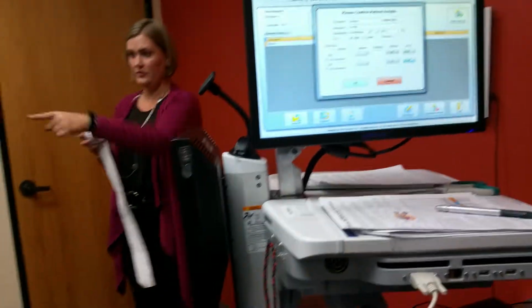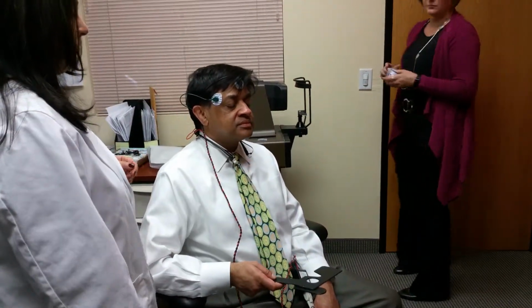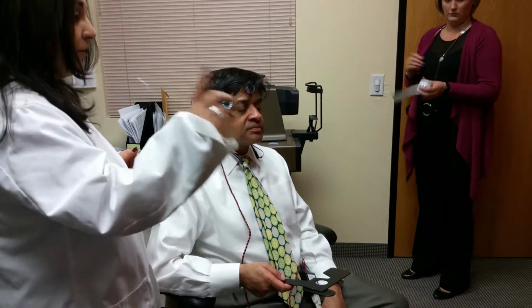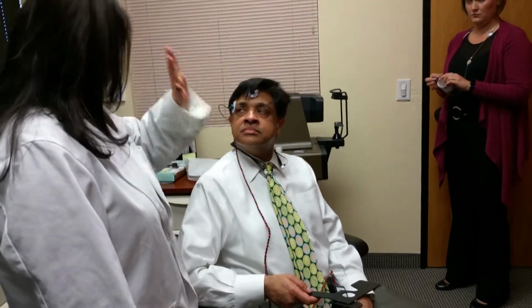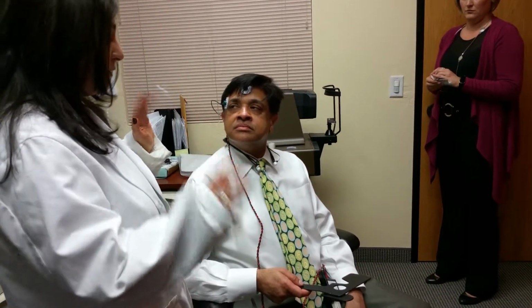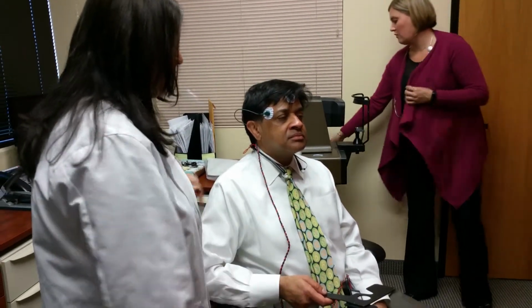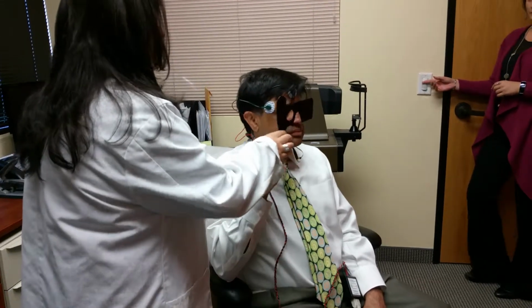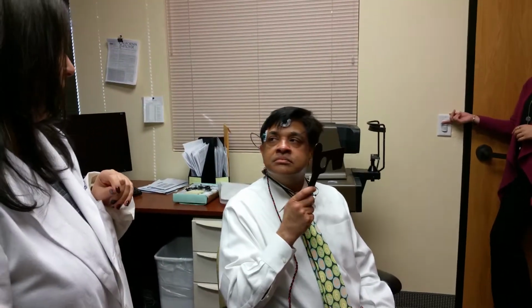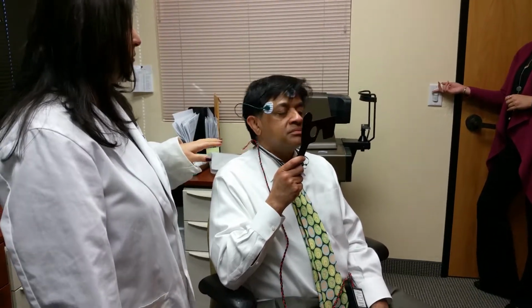And then he needs the occluder, it's right behind you. Yes, yeah. And first we can reach right eye. And do you remember what to say to him? Now, are you okay in your position? Now you can see a red circle. You have to look in a red circle. Do not think about anything. Just relax. Look to the red circle. We do one eye per time. Put your occluder on like this one. Yes. Can he blink during the test? And you can blink, but not a lot. Maybe one time. You can blink now before the test.